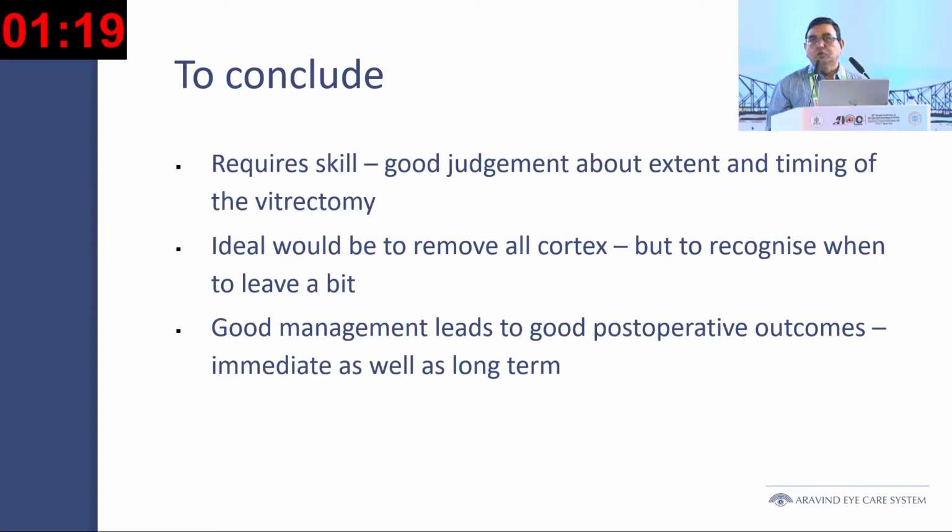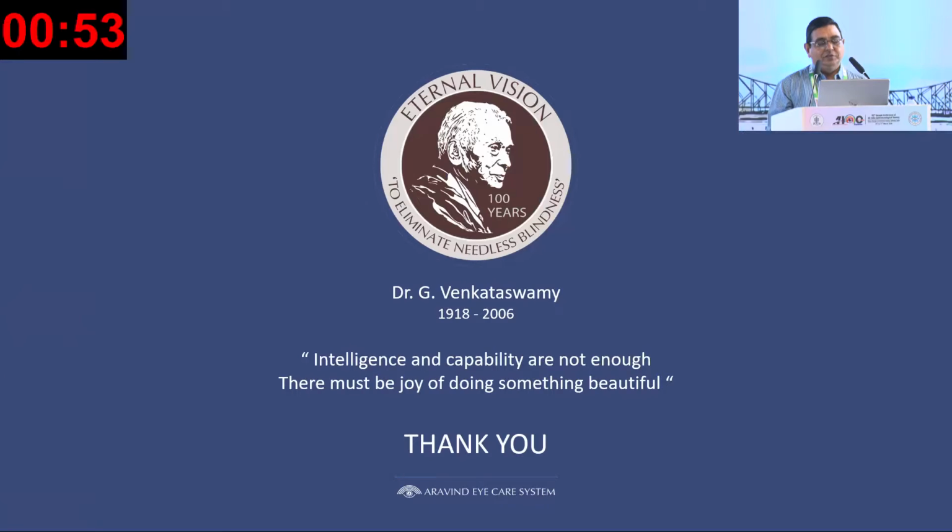To conclude, it requires skill and more so a good judgment about the extent and timing of the vitrectomy, when it is needed and how to remove the cortex. Ideal would be to remove all the cortex, but having said that, it is good to recognize when to leave it a bit if you feel that the PCR is likely to extend. In short, good management leads to good post-operative outcomes in the immediate post-operative period as well as in the long term. Thank you very much.